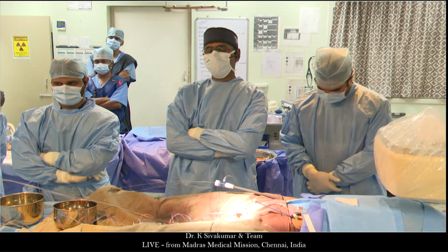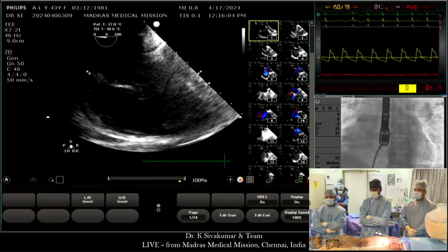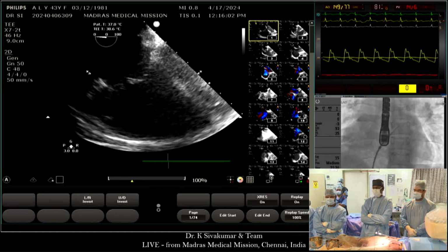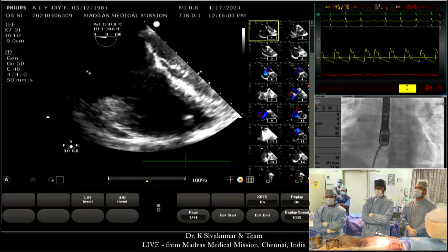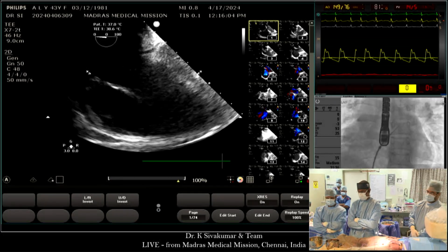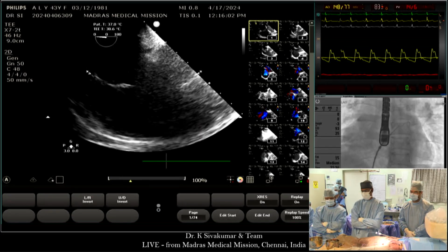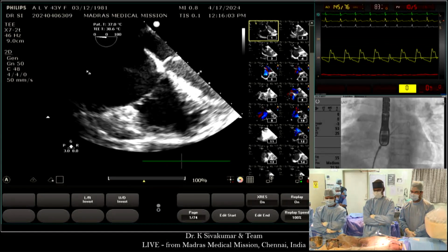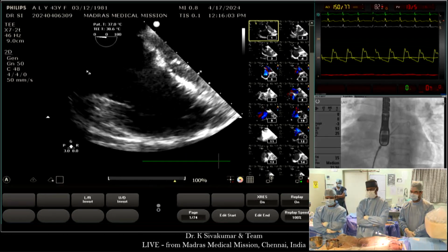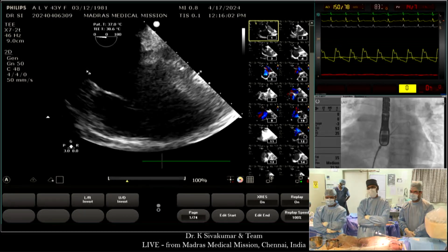Great. Zuhair. This particular patient, I think, is probably better served surgically. This is an emerging new technology. We still don't have long-term follow-up as much as we have for surgery. And it all depends, of course, on the experience of the center, but there is no doubt that percutaneous intervention is feasible. But I always say to our cardiologists that the fact that you can do it doesn't mean that you should do it.